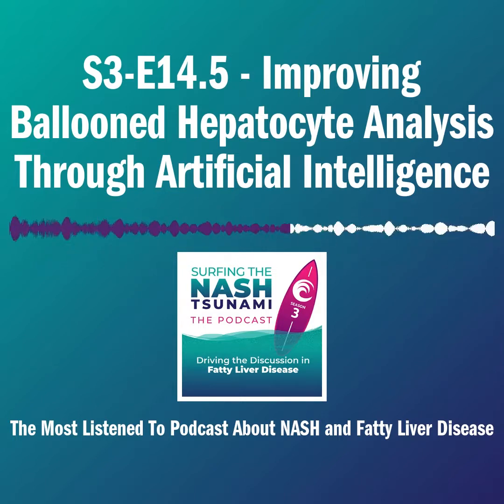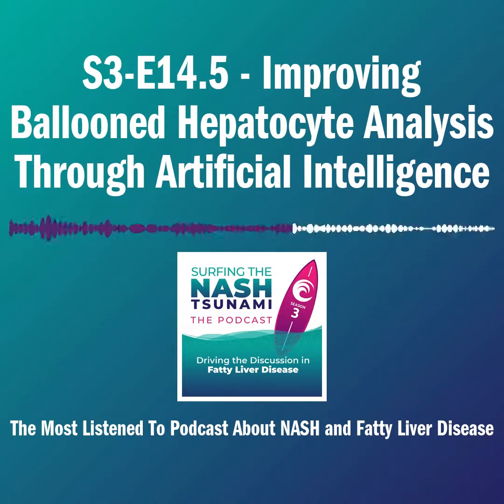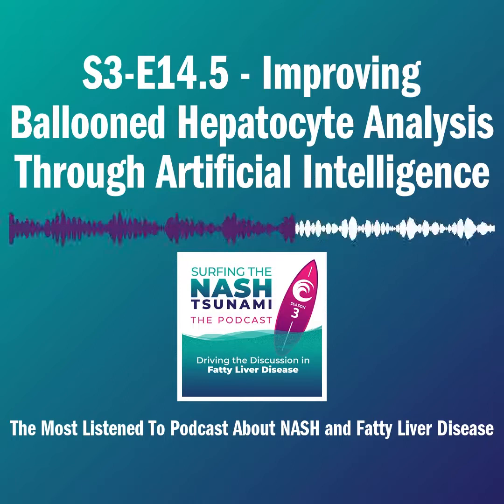The reason we used the Galectin study is that, as you know, it's one of very few studies that had portal pressures, and we wanted to correlate this new kind of histological thinking to portal pressure measurements, clinically significant portal hypertension, as well as changes in the portal pressures by 20%, which, as you know, clinically significant portal hypertension and changes in it correlated with outcomes and an improvement in outcomes. So this is when the work started.